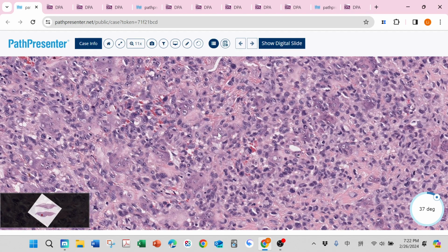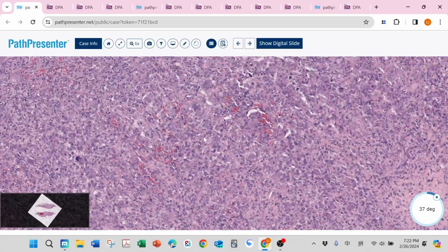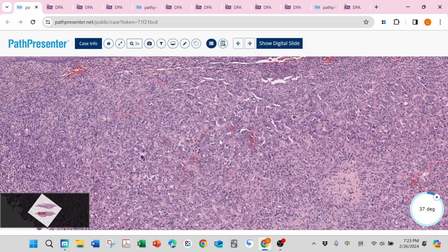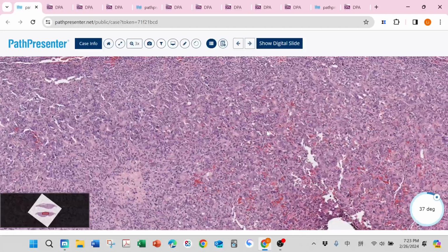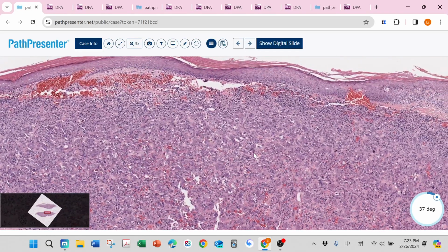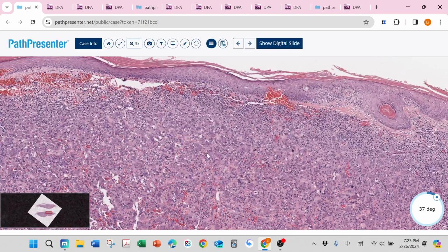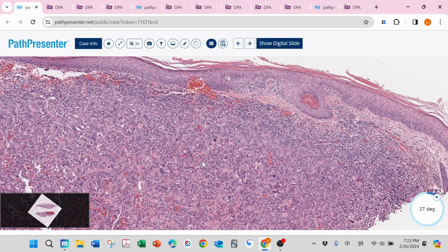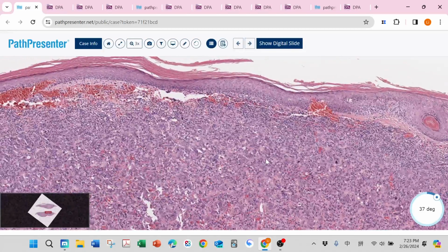For leiomyosarcoma, of course, we can do desmin and SMA, but bear in mind that SMA in AFX is not really specific but really sensitive. It will show patchy focal staining even in AFX. To call SMA positive, you need to see diffuse strong positivity, which would point to leiomyosarcoma. Desmin could be a more specific stain for smooth muscle and skeletal muscle differentiation.